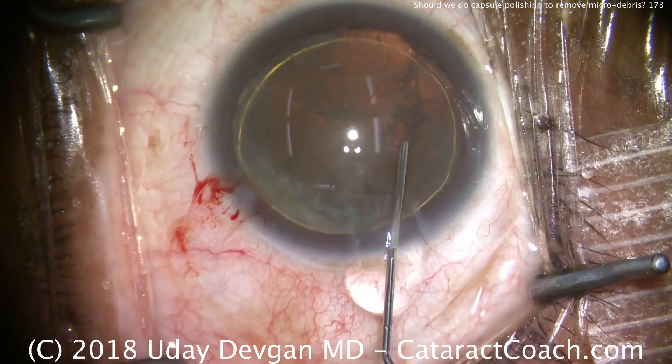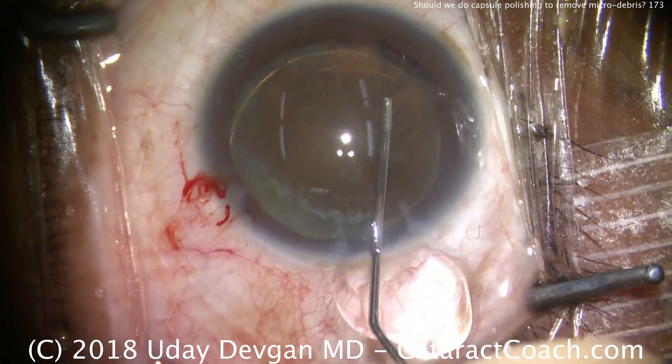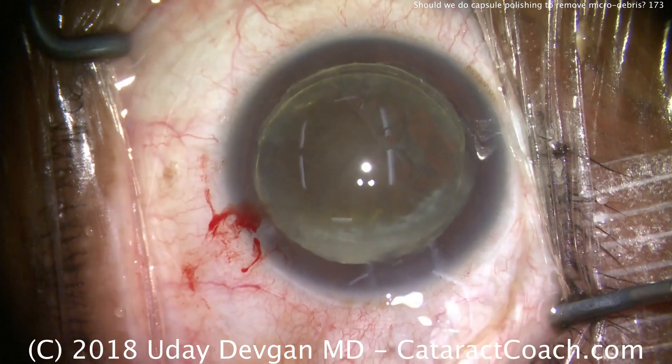Now I'm going to do some hydrodissection. There's a little delineation — there's that golden ring of delineation. I'm going to get this nucleus up out of the capsular bag.